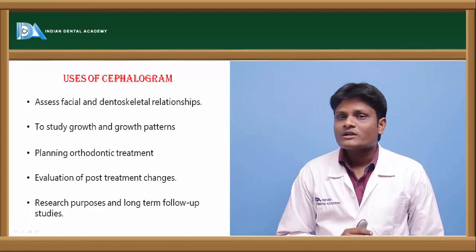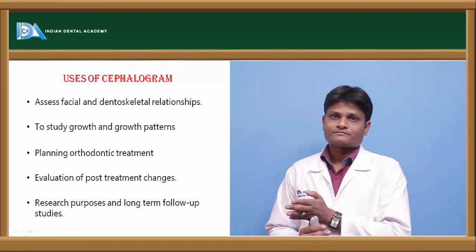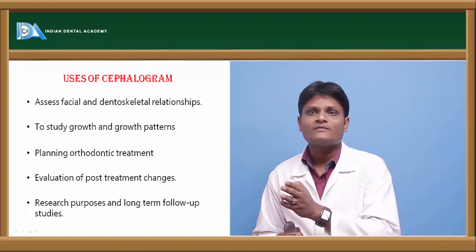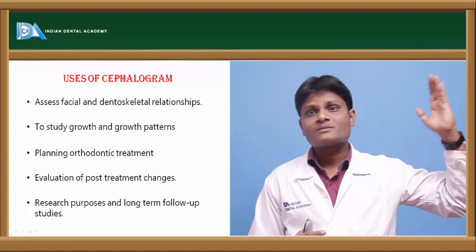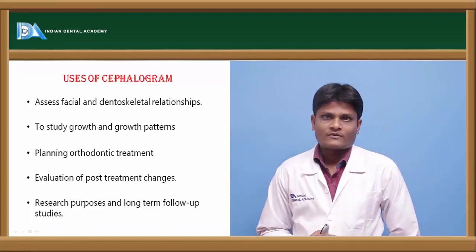And the next important use is evaluation of post-treatment changes. Once the treatment has completed, we can compare the pre-treatment lateral cephalogram with the post-treatment, and we can see how the changes have occurred with our orthodontic treatment. Whether the goals that we established before the treatment were accomplished at the end of the treatment or not can also be checked by using lateral cephalograms.